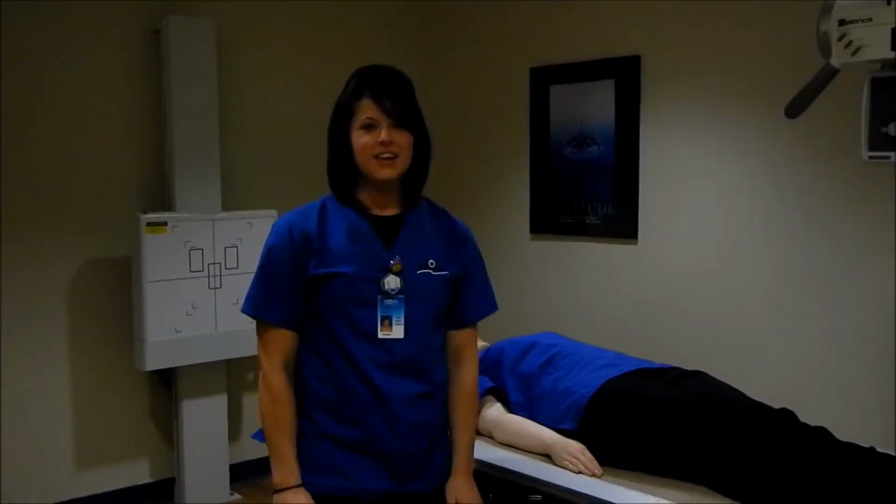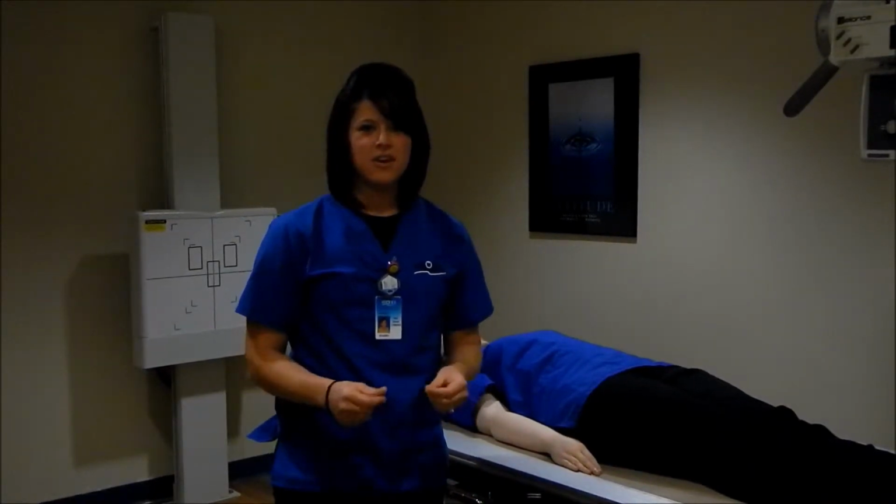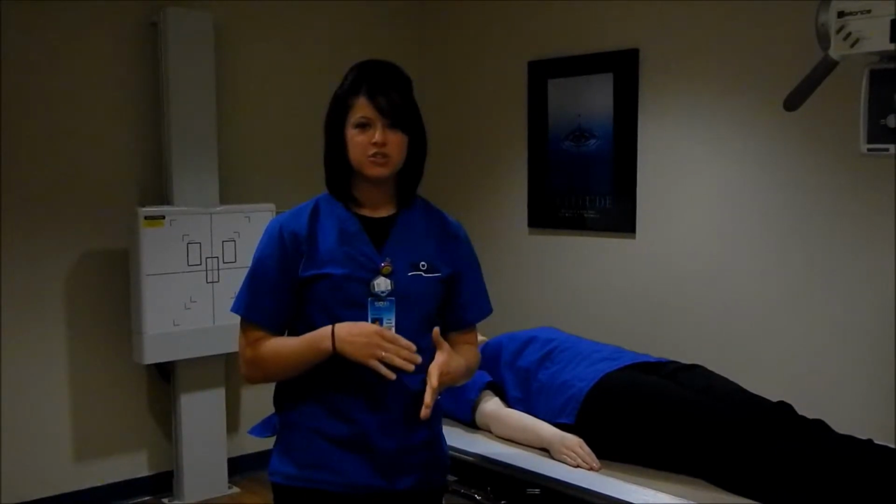The projections we're going to do are an AP supine abdomen, which will show the anatomy, and then we're also going to do an AP upright abdomen, which will show any free air in the abdomen that might have been caused by the perforation.